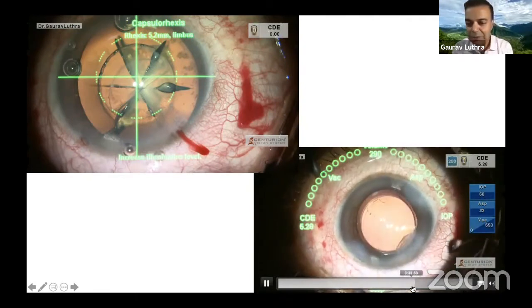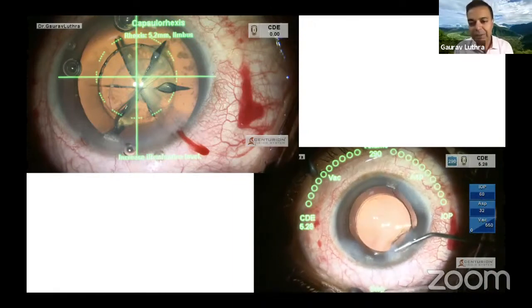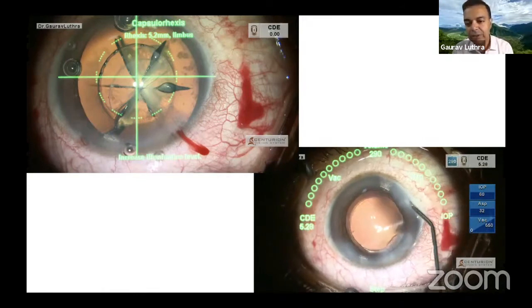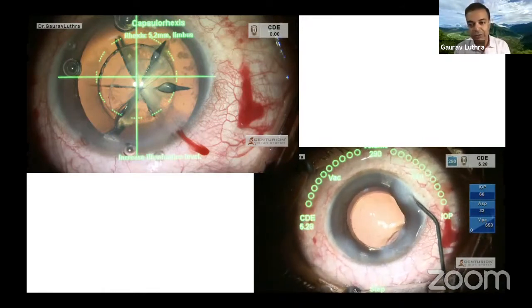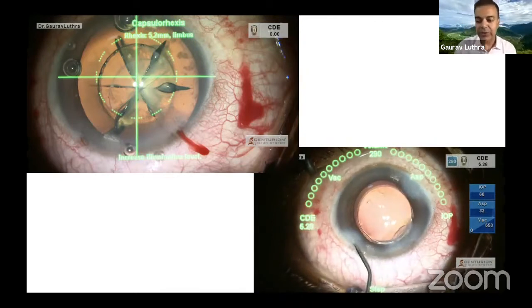Most of the time, as Dr. Pooja said, when I make my incisions with the good quality keratomes, I don't even have to seal my main ports. I can just seal the side ports and get away. And here, you're actually struggling. You're doing a quality surgery. You're doing a trifocal lens, maybe a toric, and then you don't want to compromise on your incisions.